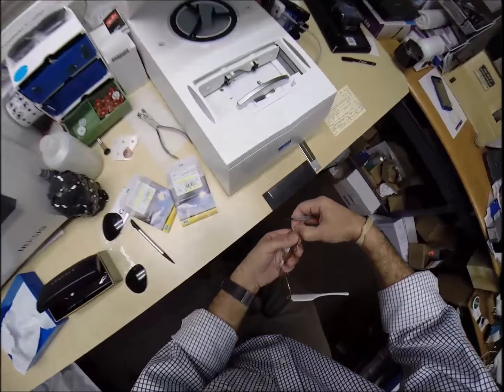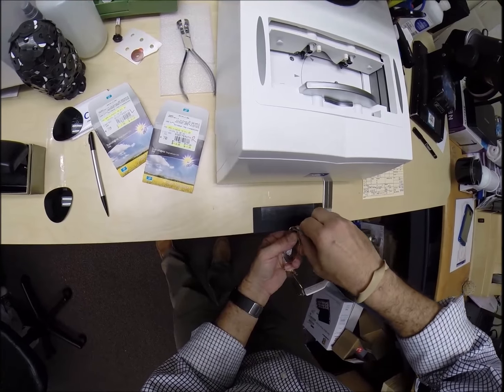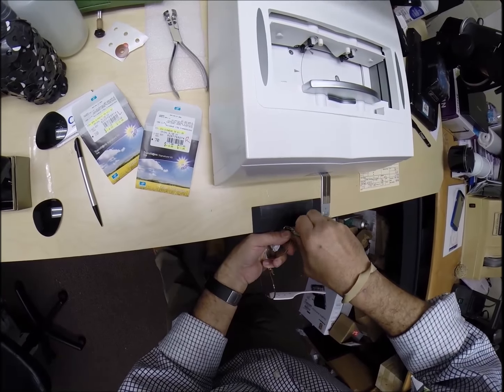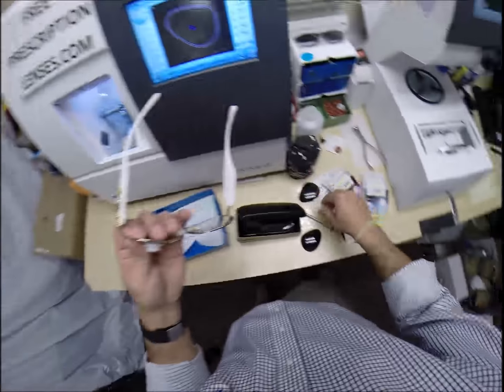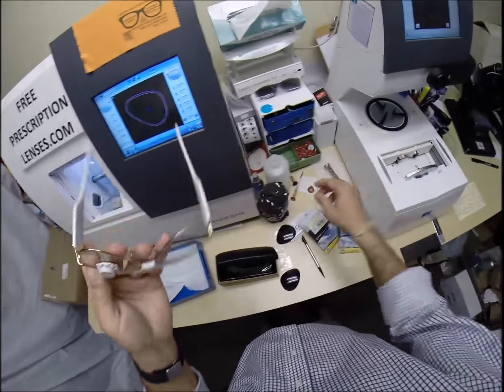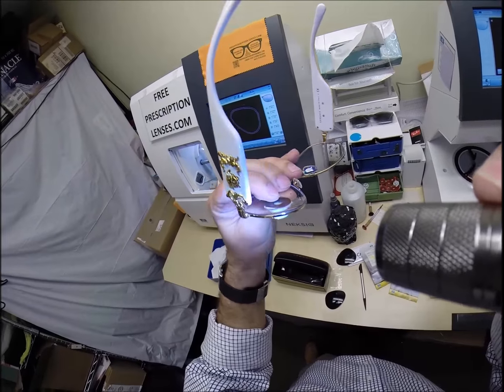So I'm going to come down here. I've got a little rubber mat on the edge of the counter, and I'm going to put your frame against that. Anyone else can use the corner of a table like that. I do it just to protect the finish of your frame. And let's get the screwdriver away from those. And that is in there perfectly. And again, no edge thickness for you, even in a large metal frame.